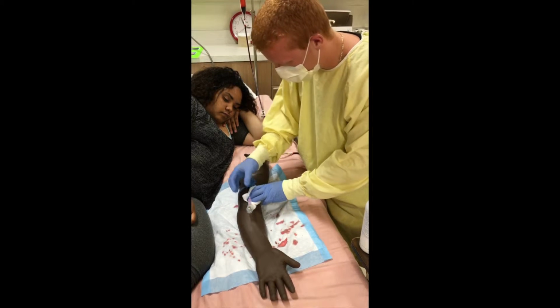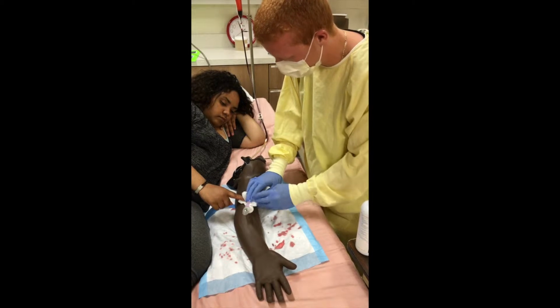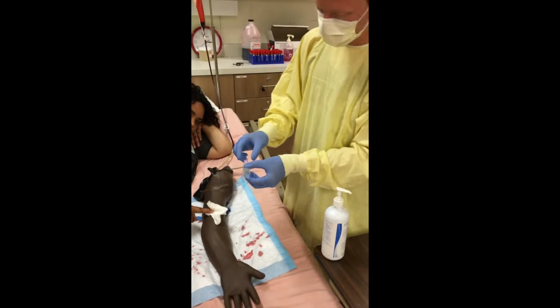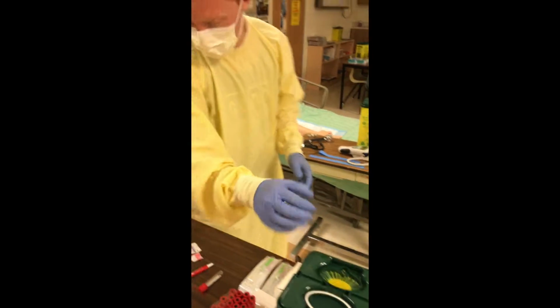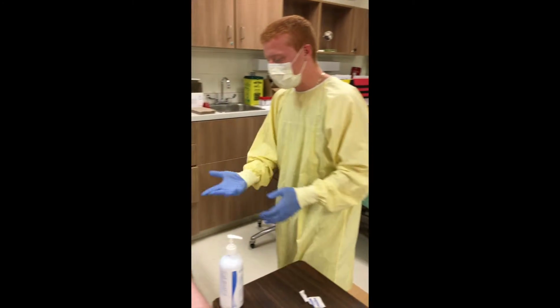Hold down the site with gauze and undo the tourniquet. Ask the patient to hold and remove the Vacutainer. Put the protective seal and then dispose of it safely. This is contact isolation, taking blood.